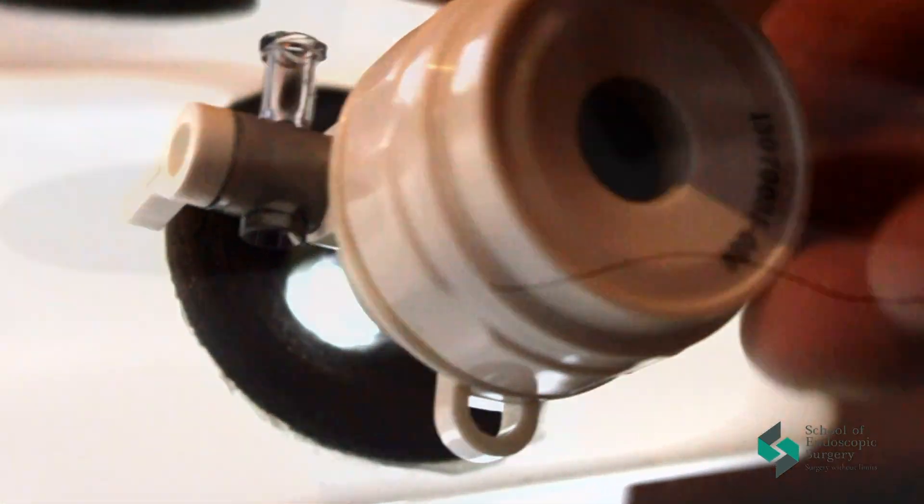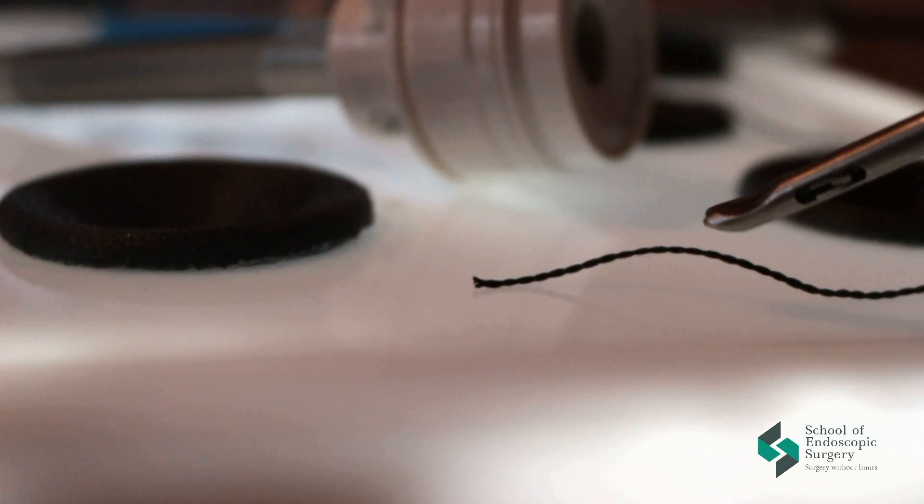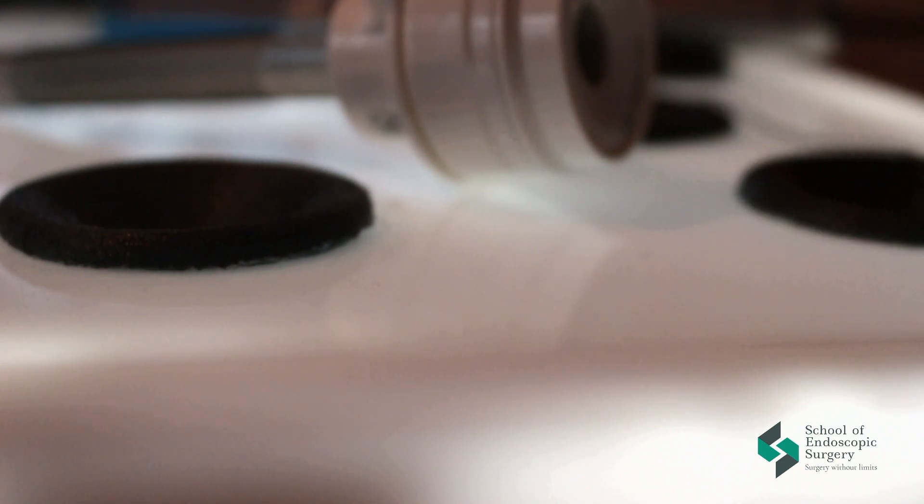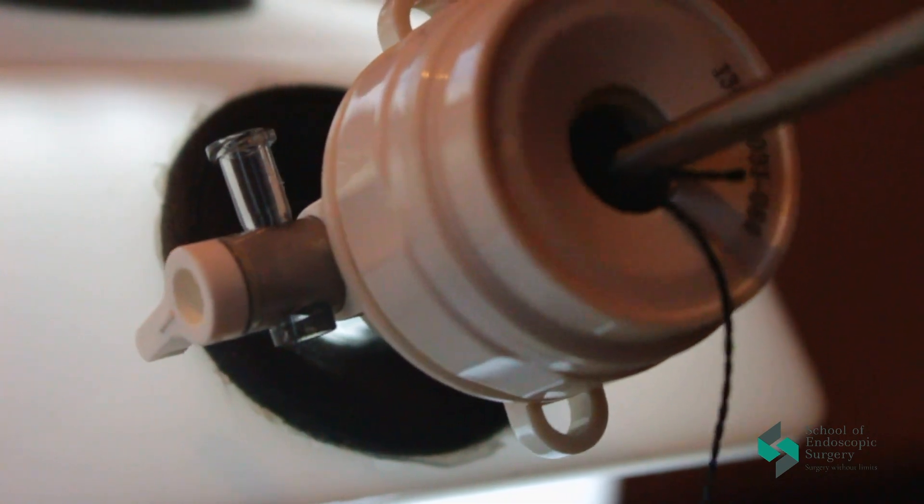After we have inserted the thread into the trocar, our long end of the thread should remain outside. The short end of the thread inserting through the ring or stitching the tissues.